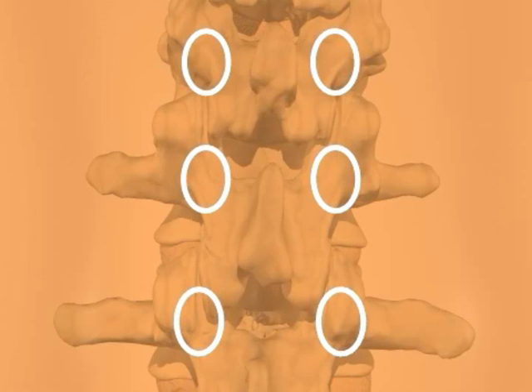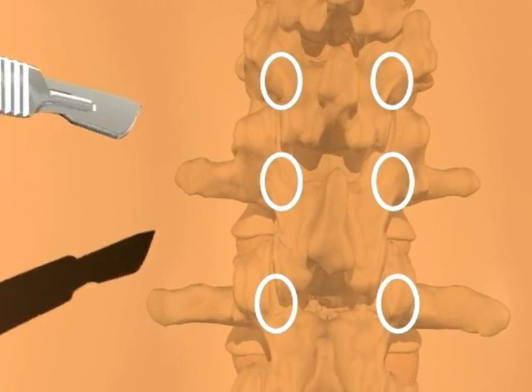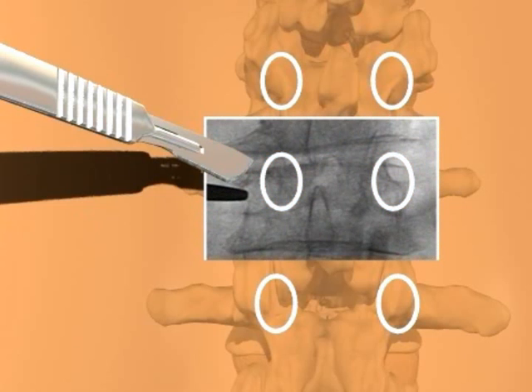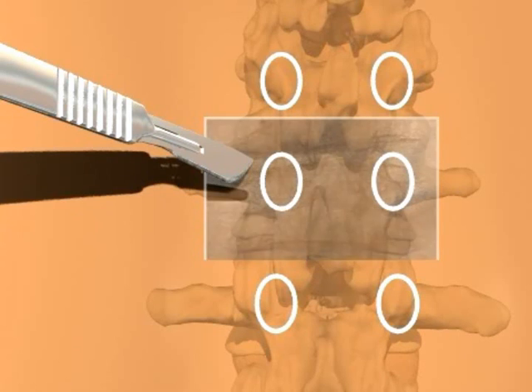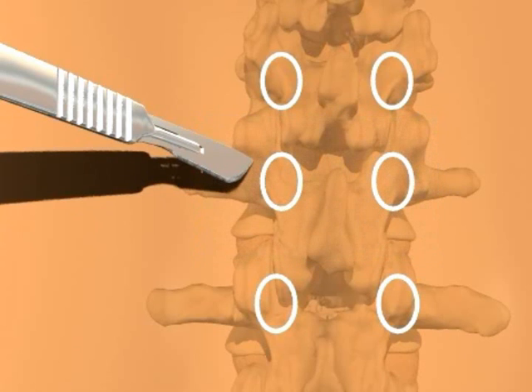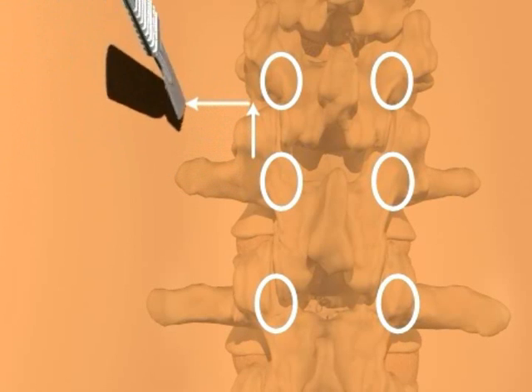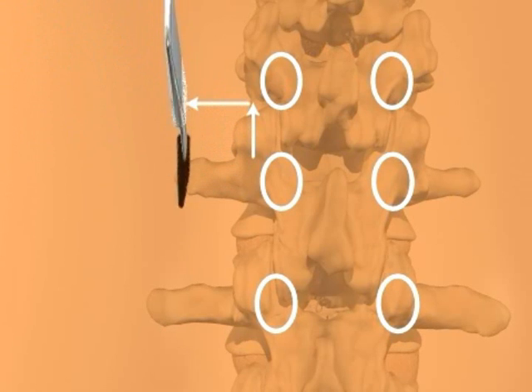patient. Use fluoroscopy to locate the pedicle cutaneously with either a clamp or a scalpel in true AP view. An incision less than 1 centimeter in length is required. The incision is placed lateral and superior to the cutaneous pedicle location. This allows proper convergence through the tissues to the entry point on the pedicle.